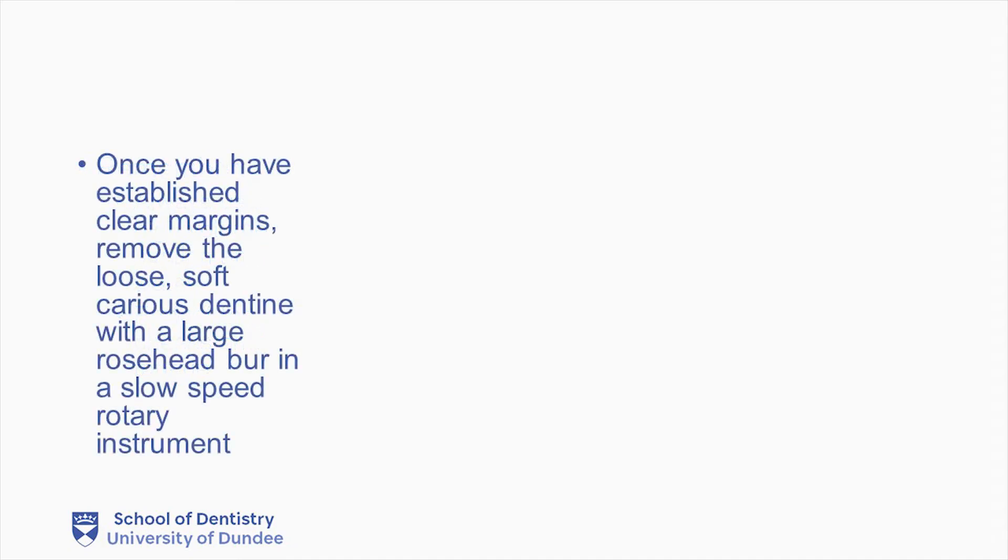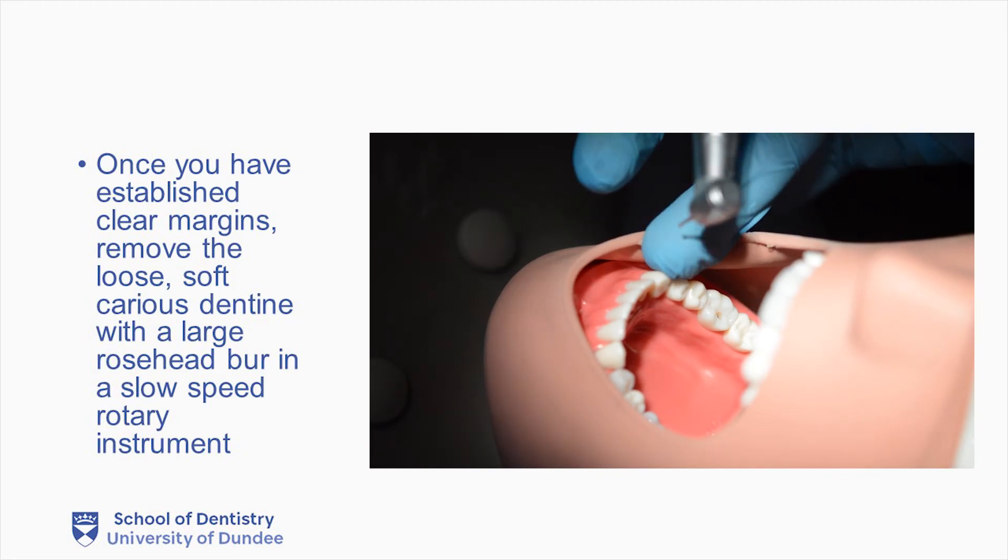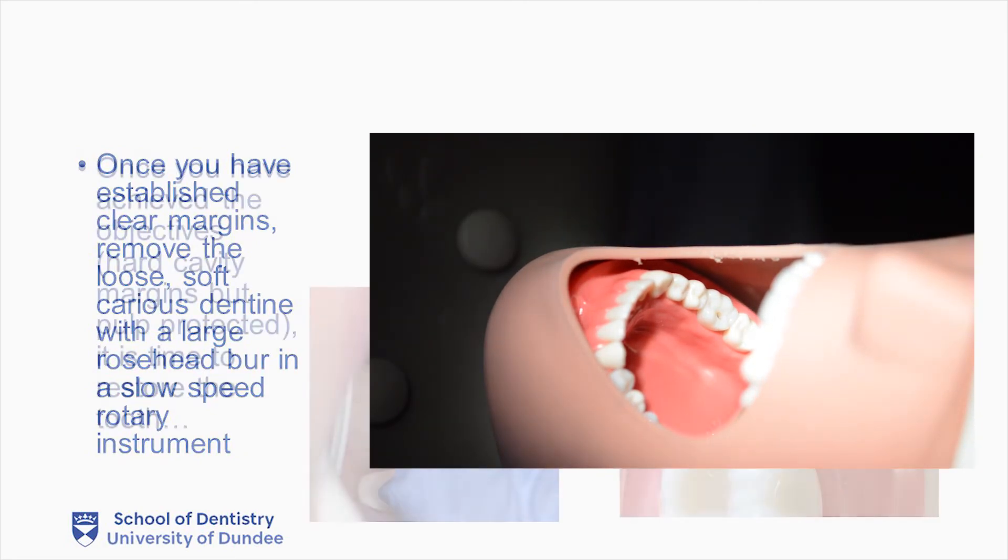Once you have established clear margins, remove the soft, loose carious dentine with a large rose-head bur in a slow-speed rotary instrument. Once you have achieved the objectives — in other words having hard cavity margins but keeping the pulp protected — it is time to restore the tooth.